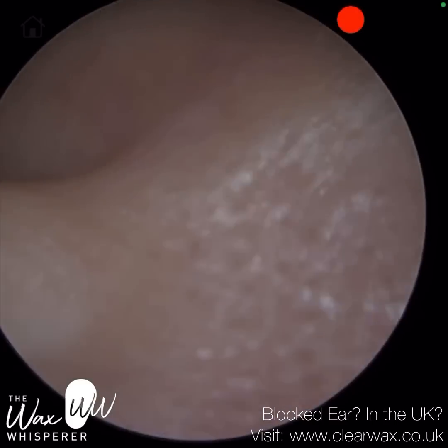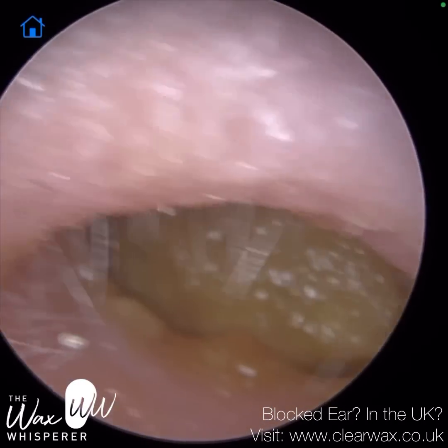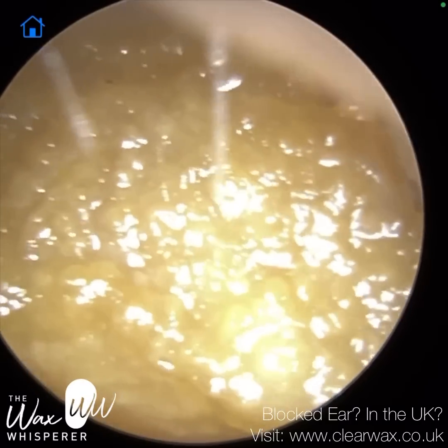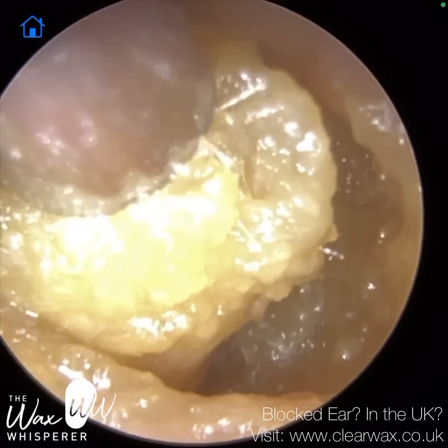Hi everyone, this is Neil Raithatha, also known as The Wax Whisperer. Thank you for joining me in my latest video. We have here a patient who attended with bilateral fully occluding earwax and dead keratin. We're commencing with their left ear first, and they had used some olive oil ear spray prior to attending.